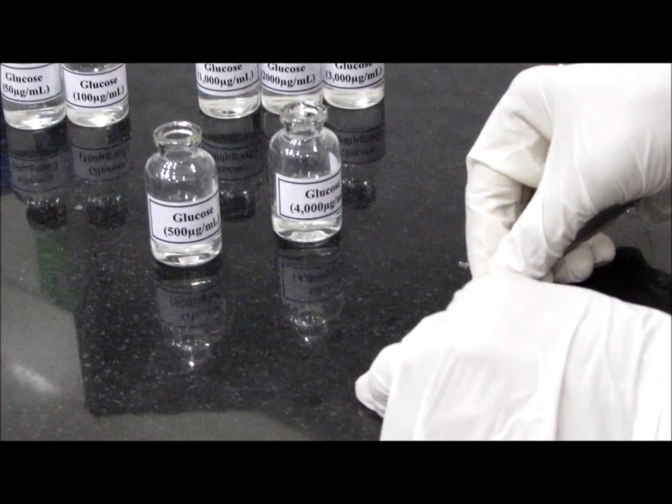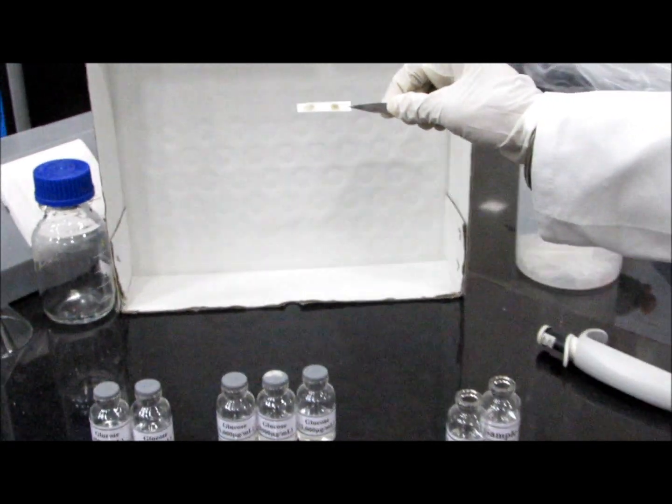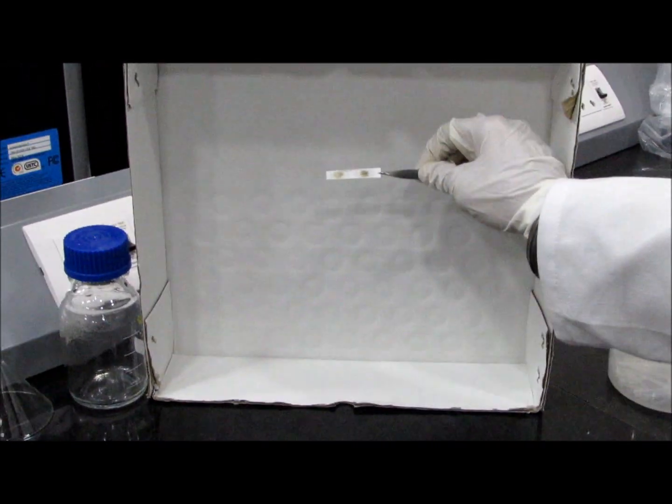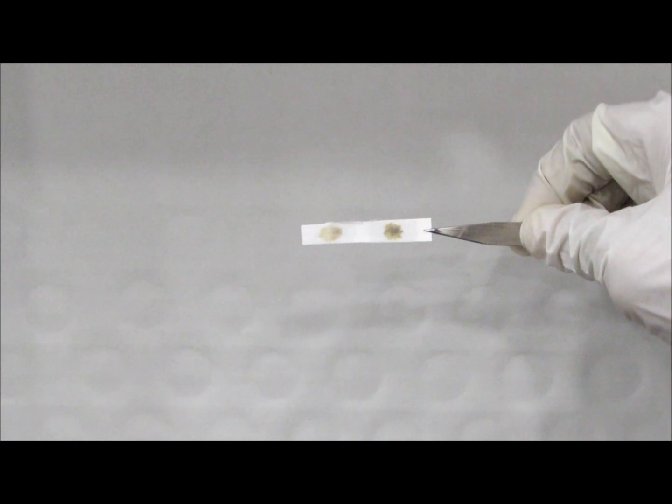Now we can clearly see that two different spots have developed due to the difference in the concentration of the glucose. So we can clearly differentiate the high glucose concentration and low glucose concentration from urine or blood sample or saliva.